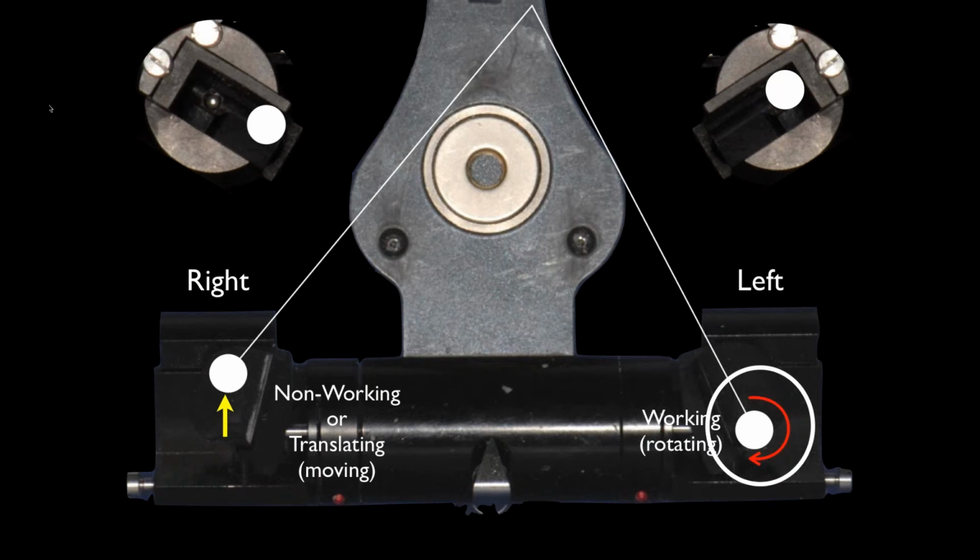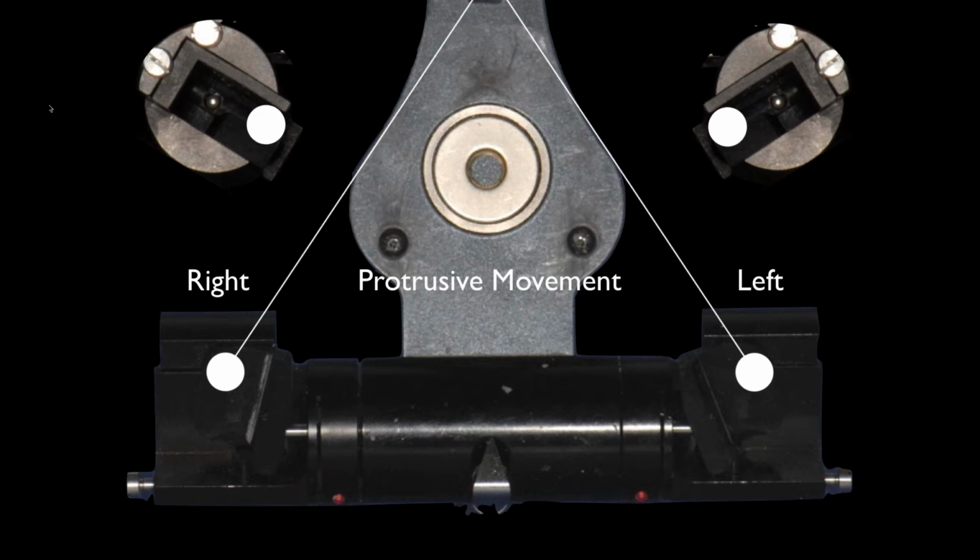And it also moves downward, again by an amount based on the level of the condylar guidance. The steeper the guidance, the more it physically moves down as it moves forward. And as we go through this program, we're going to see how understanding this is the key to understanding a lot of how to better adjust our cases and better design our cases.